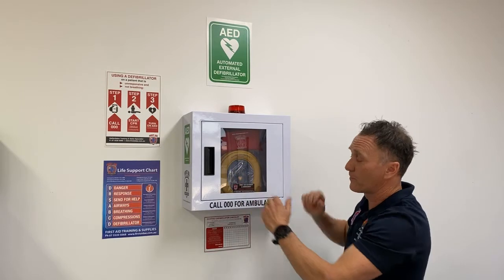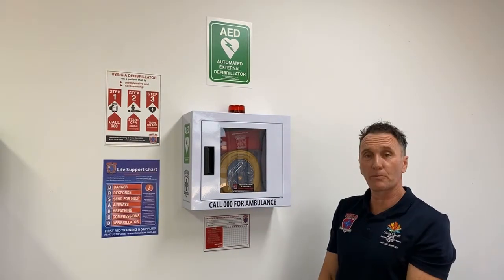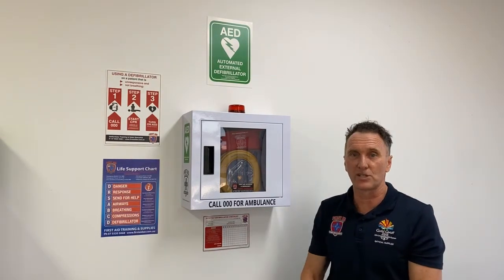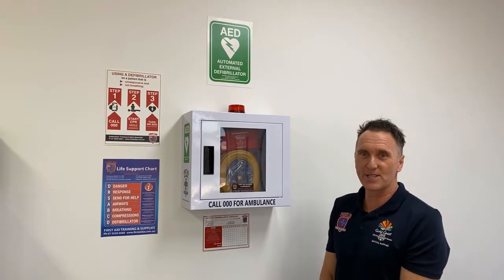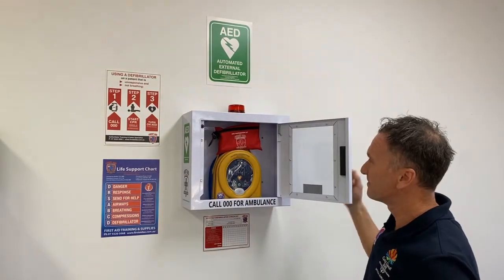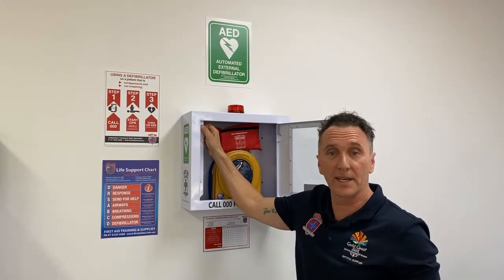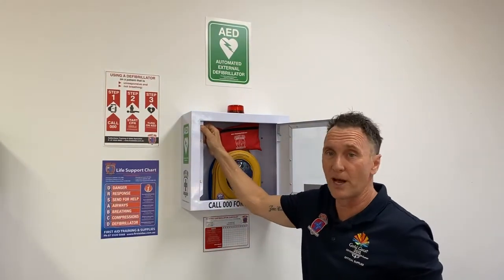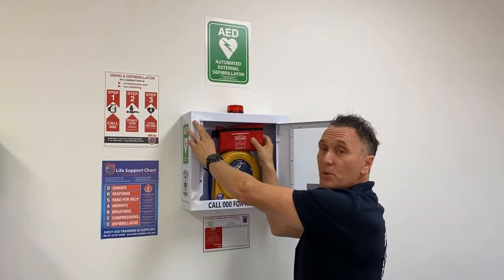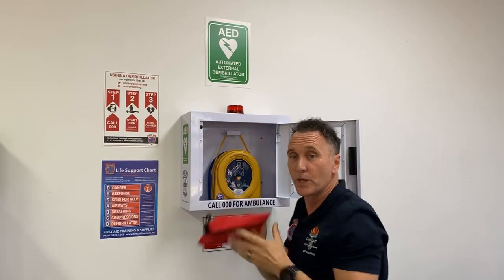We also have a metal alarmed wall cabinet with this package. It's got a pressure plate in it — when you open it, it sounds quite loud and it flashes, because you want to know when someone's accessing your defibrillator. You can turn this defibrillator cabinet off quite easily by pushing the pressure plate, and it also has a 9-volt battery that sits within there that you can turn on and off when you're servicing your device.